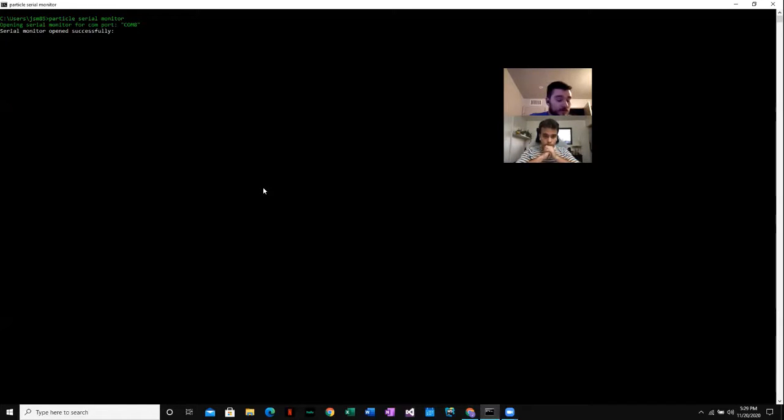So the monitor is open successfully. You'll see that the Argon is flashing itself right now. It's going to take a quick second to do that. And you'll see some lines printing. The API key matches what we see on the web page, and it's going through this initializing process. So you can or cannot have your finger. The LED is red during the initialization process.